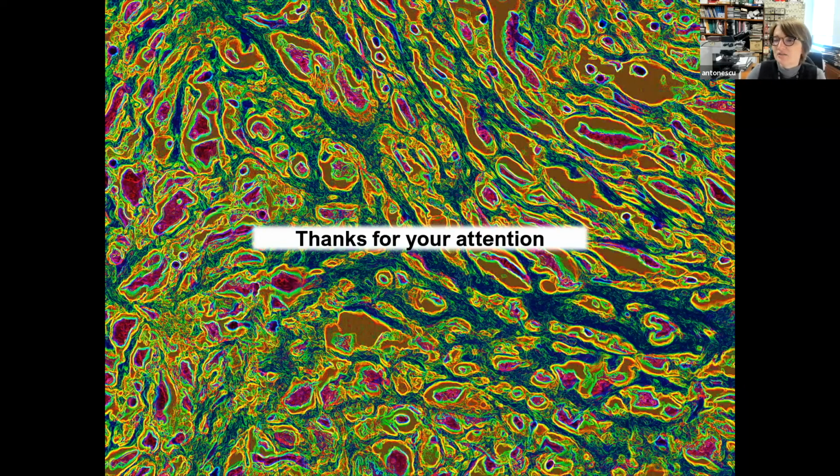So that's one clue. Second, the morphology that you showed was so variegated, right? From spindle fascicular to epithelioid to round, undifferentiated, anaplastic. So this morphology is unlikely, as I mentioned before, to be a fusion-associated sarcoma.